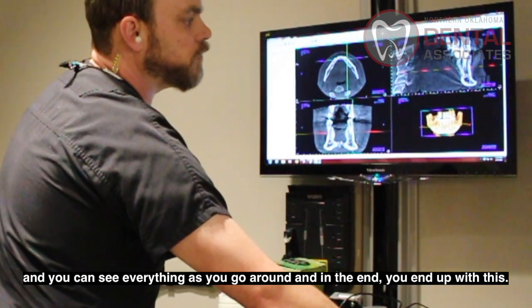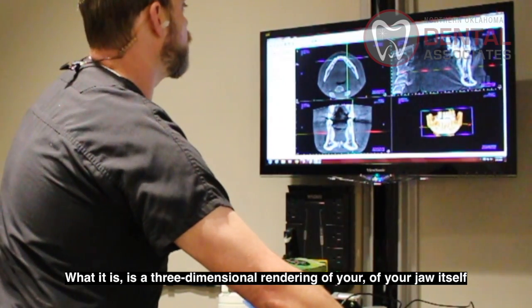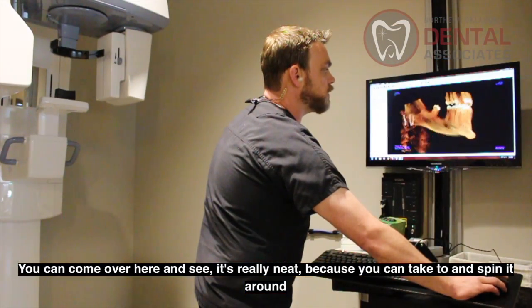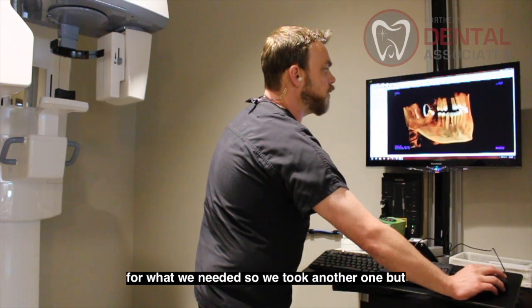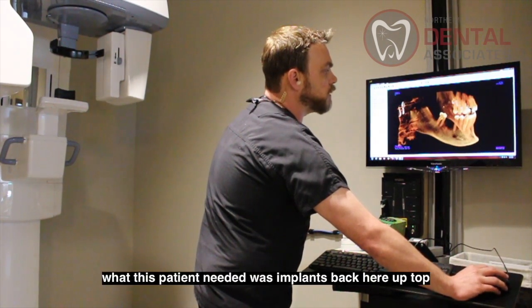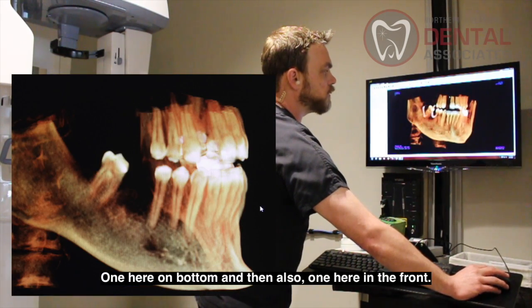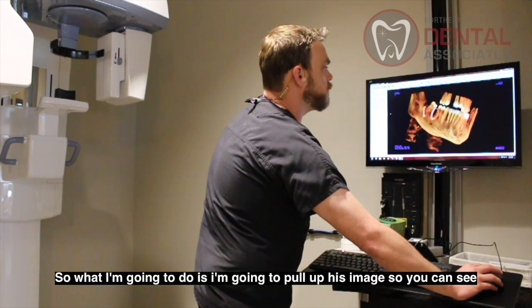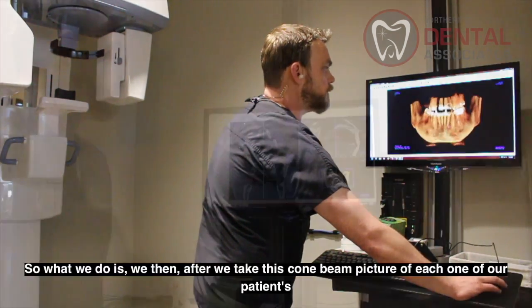So you scroll it, and you can see everything as you go around. And in the end, you end up with this: a 3-dimensional rendering of your jaw itself. It's really neat because you can spin it around and look. Now this cone beam was a little bit too short for what we needed, so we took another one. But what this patient needed was implants back here up top, one here on bottom, and also one here in the front. So I'm going to pull up his image so you can see exactly what it looked like whenever we got it all finished up.